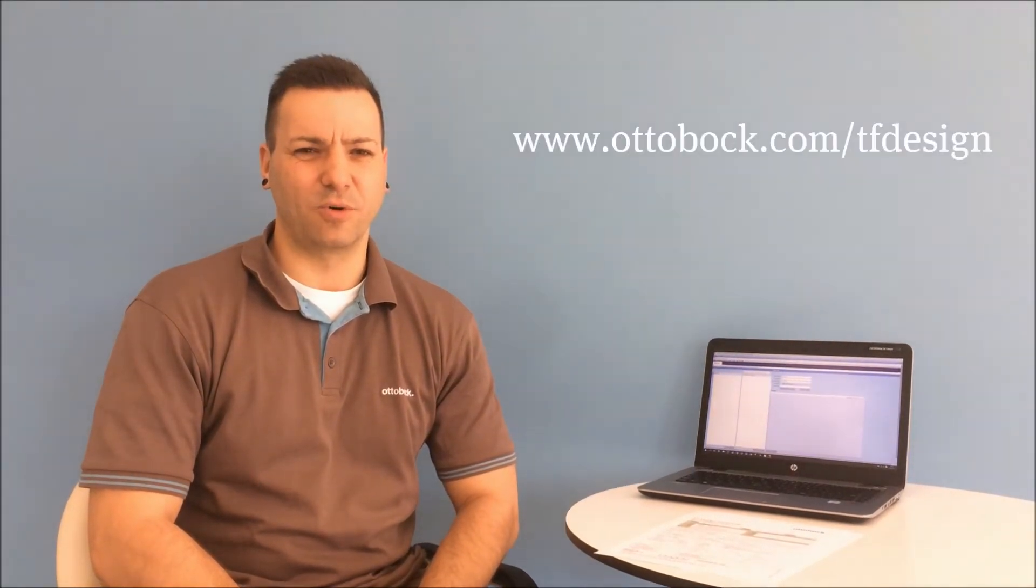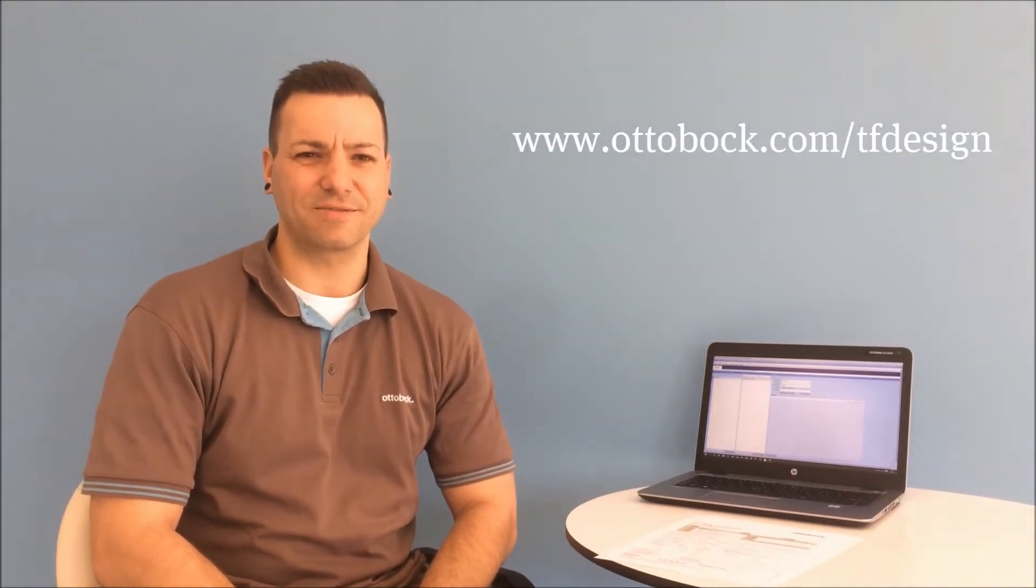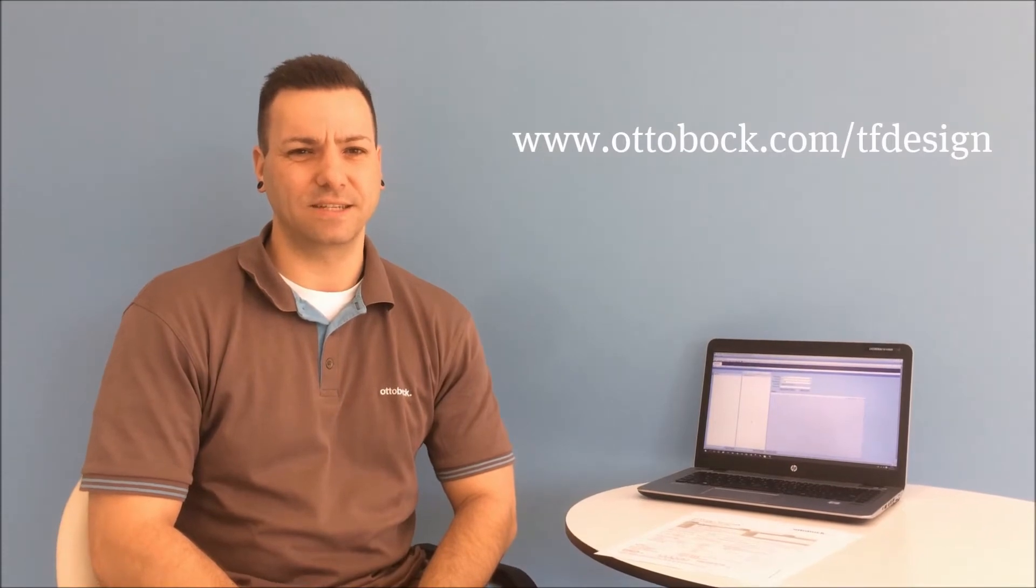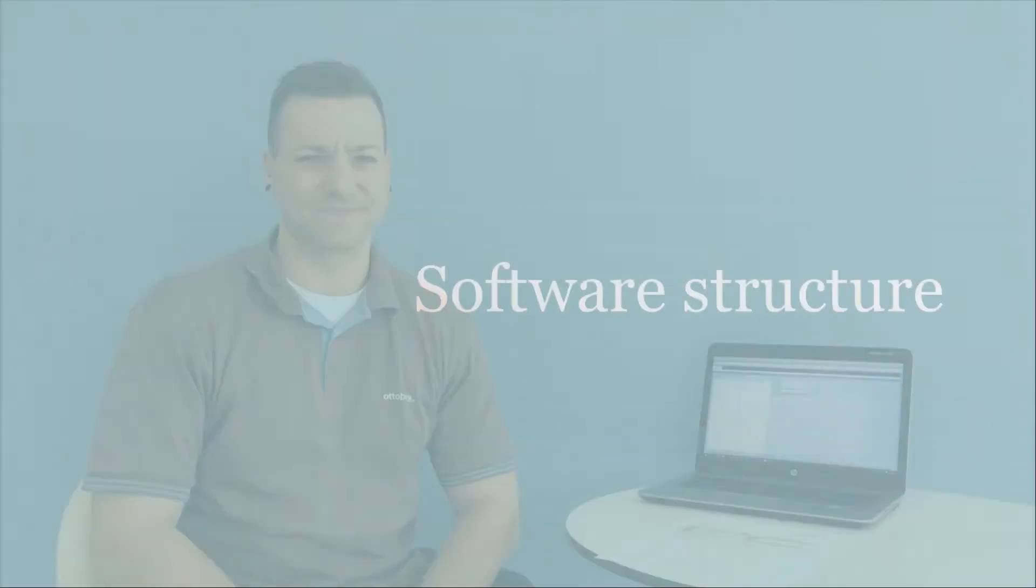Welcome to our tutorial on using the TF design software. The 647x6 software can be downloaded on the Ottobock homepage or alternatively ordered as a CD. The software can be started following the installation.